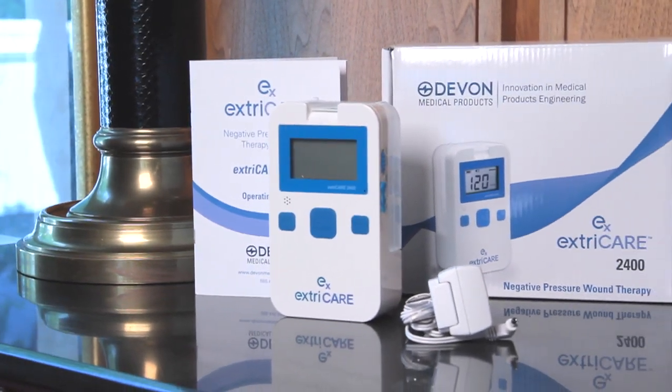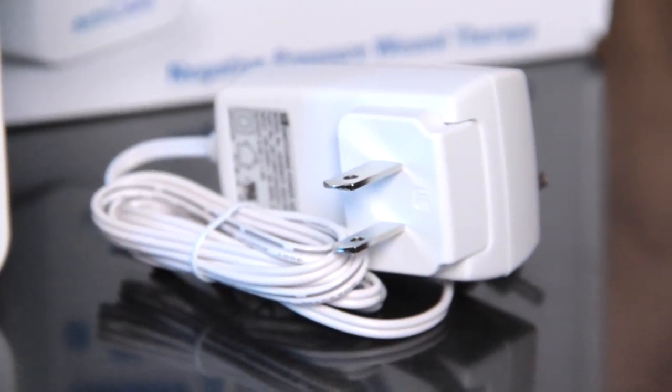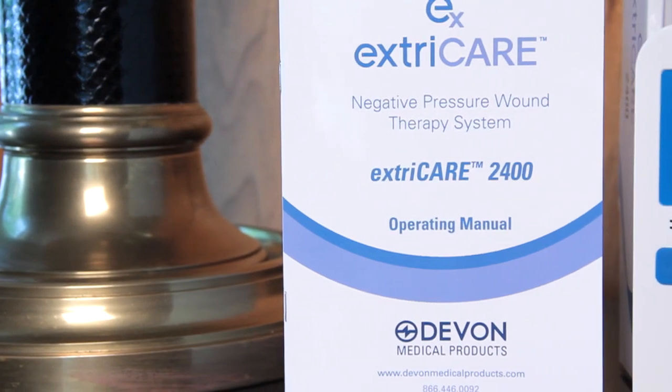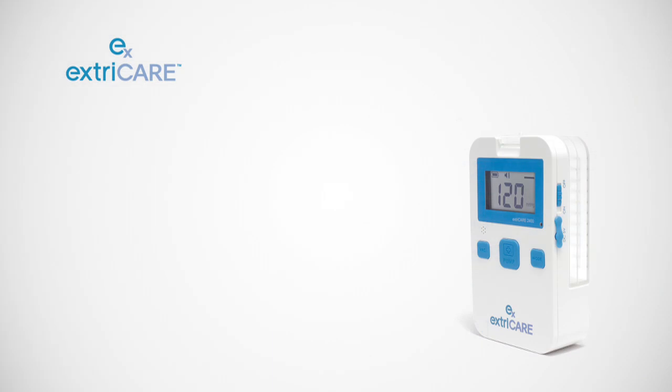Each ExtraCare comes equipped with one AC power cable, one 100cc canister, and a user manual. Bandages, additional canisters, carrying cases, and other accessories are sold separately.